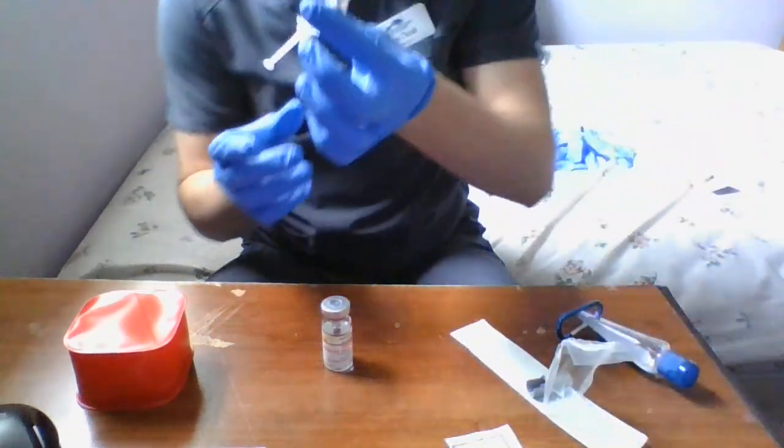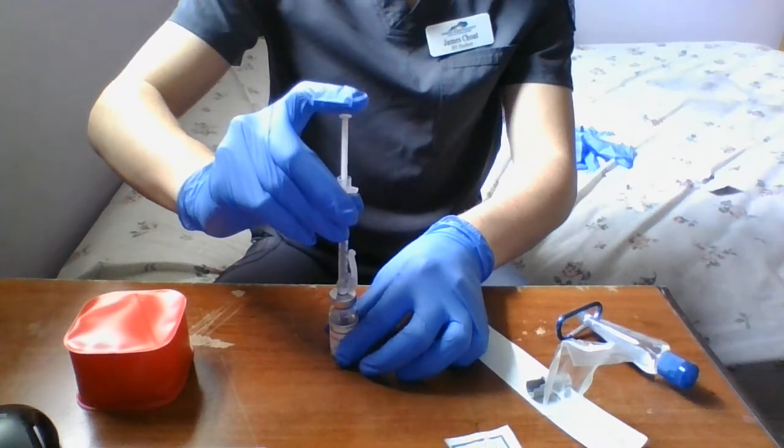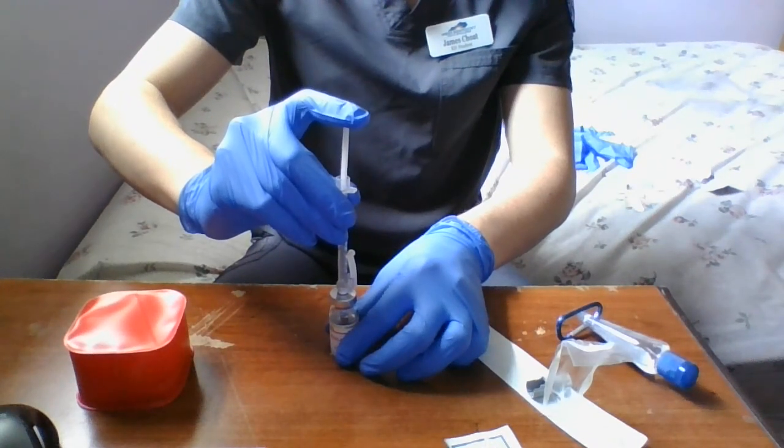We're at 0.6, and I'm going to inject that into the rubber seal. Inject the air into there.